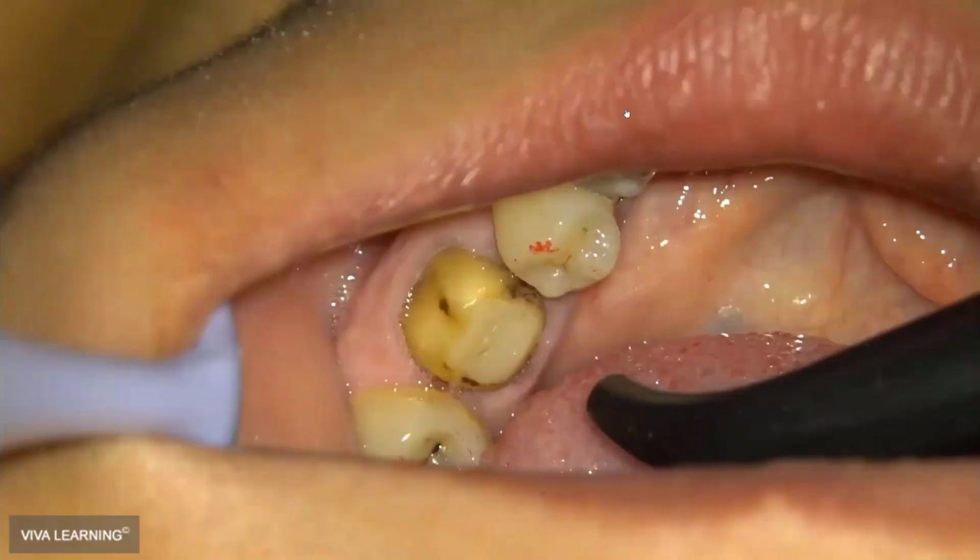So in this case, the story of this case is the following. The patient had a crown here. The crown decemented. It was not done by us, but this doesn't matter. She just came into the dental office, said, you know what, I had a crown here. I don't know, I was eating something and I just swallowed the crown. I need a new crown. So this is the preparation. We took the impression, and because we didn't have a crown to start and make a direct temporary crown and bridge, and we didn't take any impression to make a temporary, when the patient came into the dental office to cement the crown, of course we have biofilm, yeah?